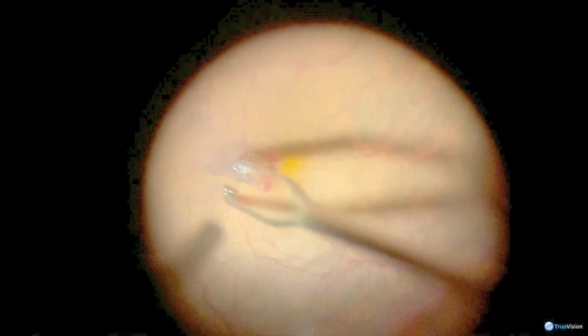The actual example that I showed, in retrospect, I probably used the loop more than I needed to. Really, all you need to do is just gain a small edge. And once the edge has been raised, then the ILM forceps work very well to go ahead and remove the ILM, as you can see, in a capsular rhexis type manner.